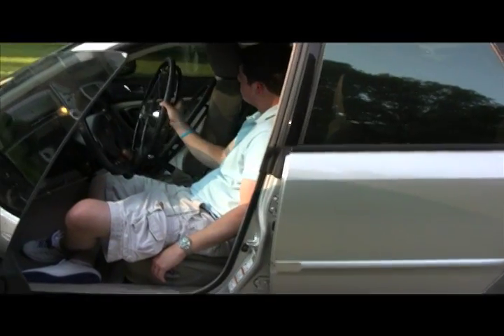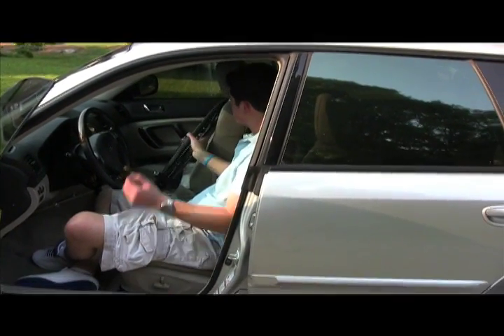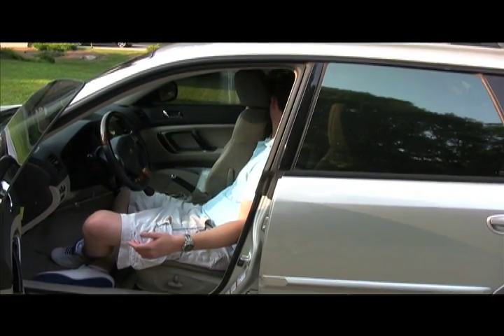And I like to move my wheels to the back seat for a variety of reasons because it can give you more passenger room, and also when you're stopping and going, you don't want the wheels to come over and hit you when you're trying to drive.